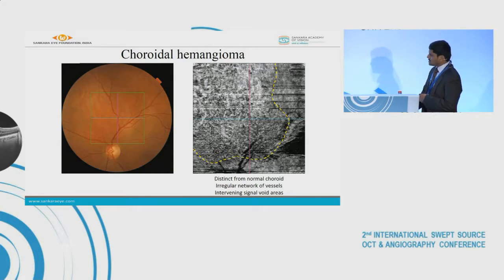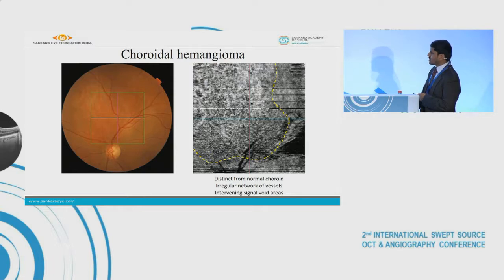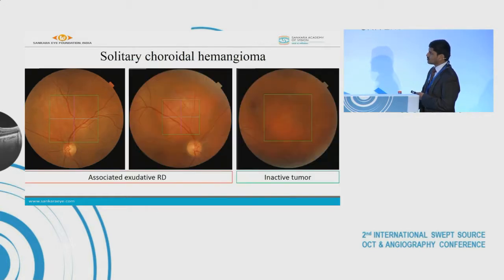It consists of an irregular network of vessels with both large caliber and small caliber vessels. The caliber of the vessels varies from location to location, and there are intervening signal void areas which likely represent the interstitial tissue.